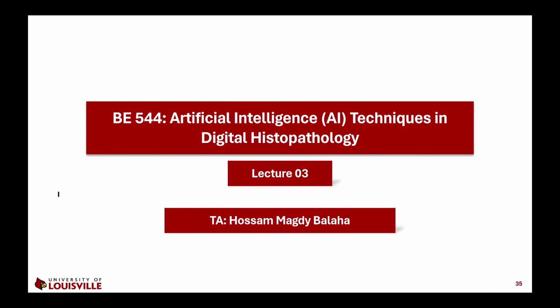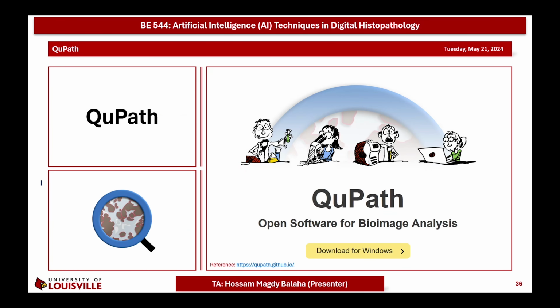Hello everyone, this is lecture 3 from BE544. In today's lecture, we will deal with QuPath. As mentioned in the previous lecture, QuPath is software for bioimaging analysis. It can handle whole slide images, annotate them, and perform different diagnostics on them, such as classification and detection.